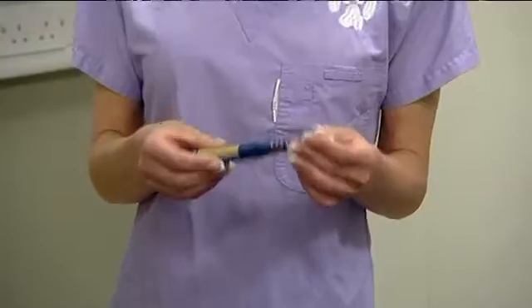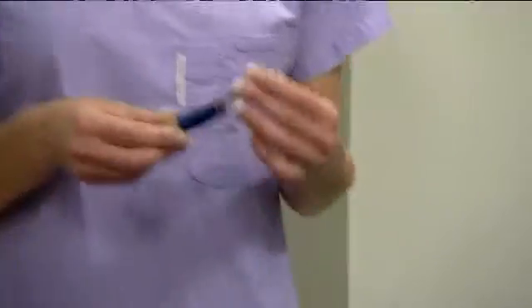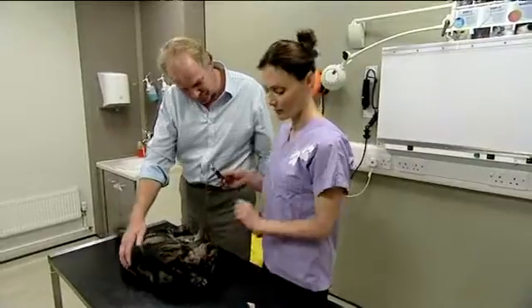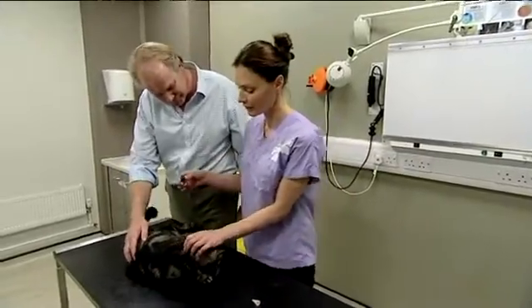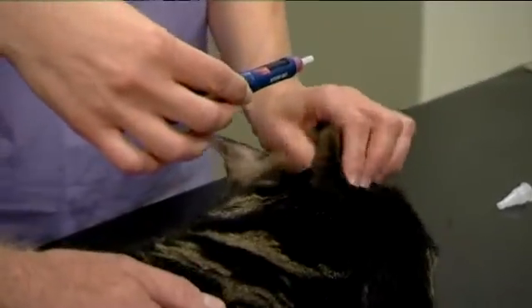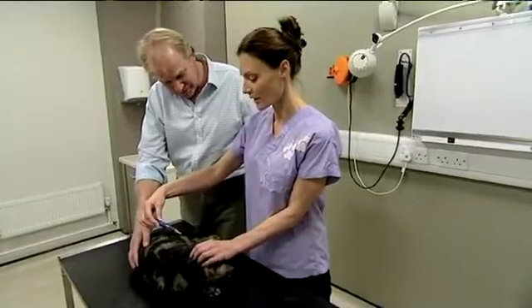So simply select your dose on the pen by using the dial here, and then simply remove the top, take the scruff of the neck. That's where you're going to administer your insulin — under the skin, subcutaneously.